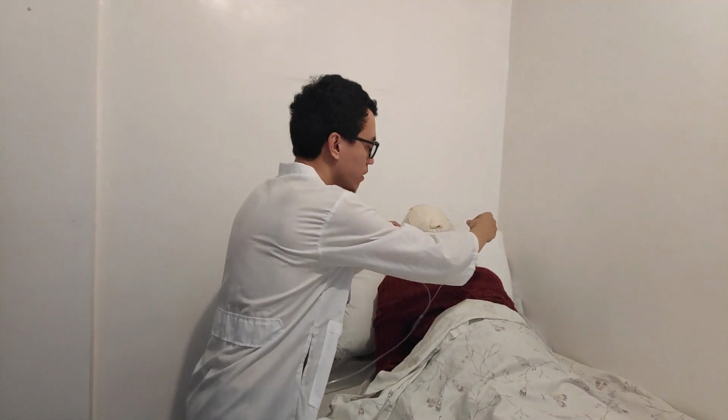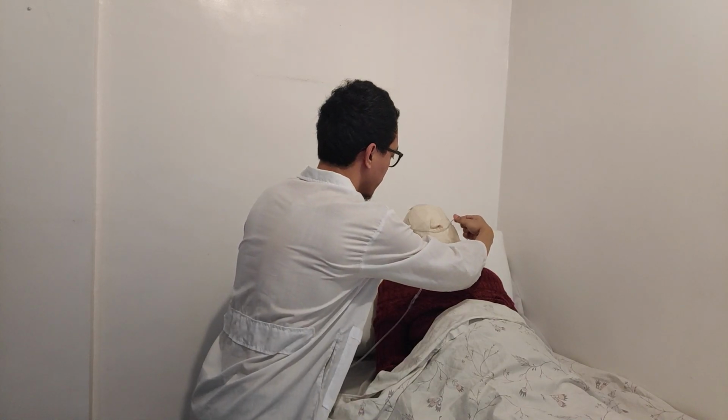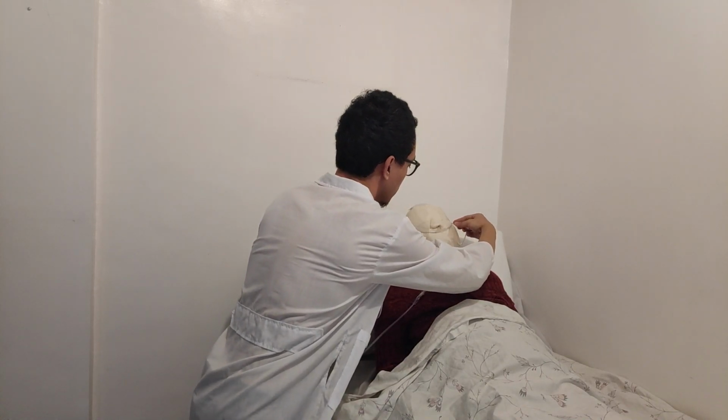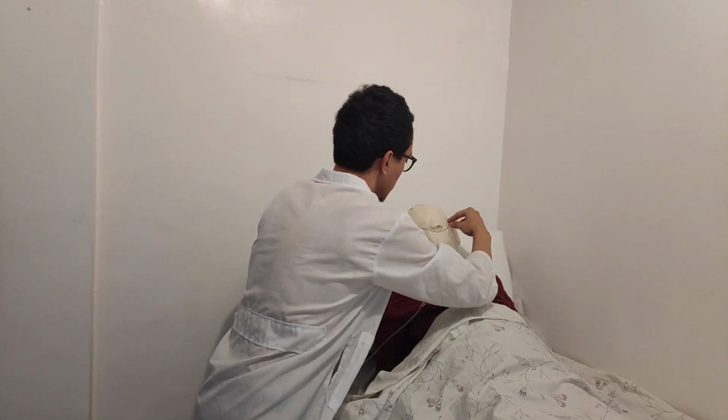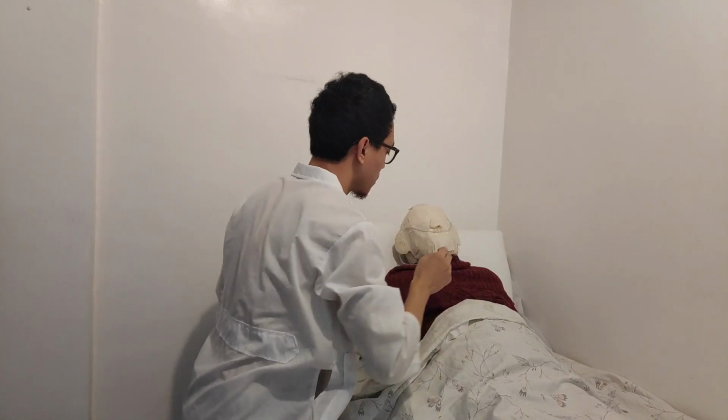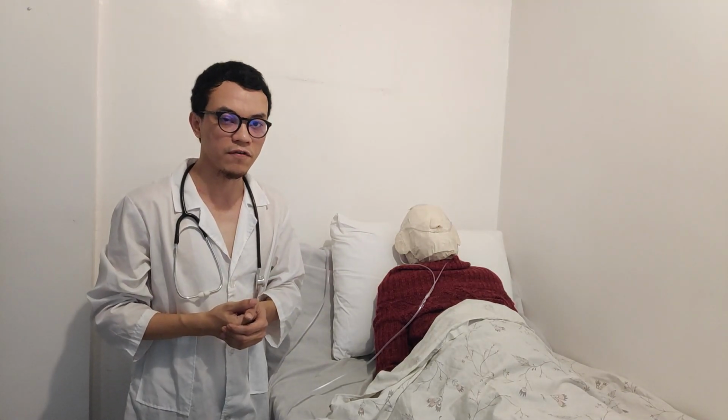Place the tubing over and beneath the ear, with the adjuster under the chin. Alternately, you can place the tubing around the patient's head with the adjuster at the back or base of the head.